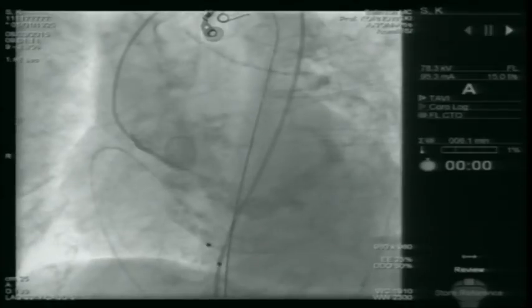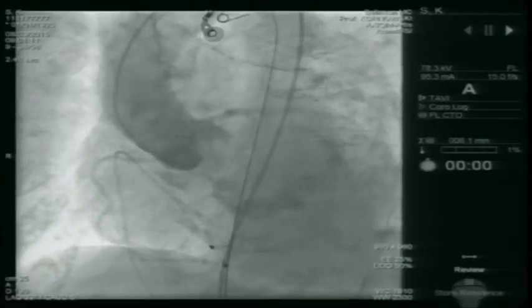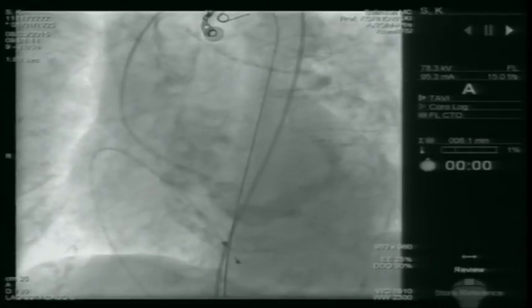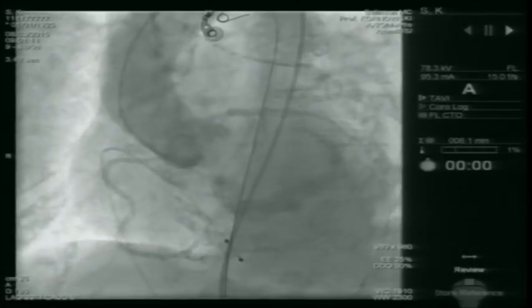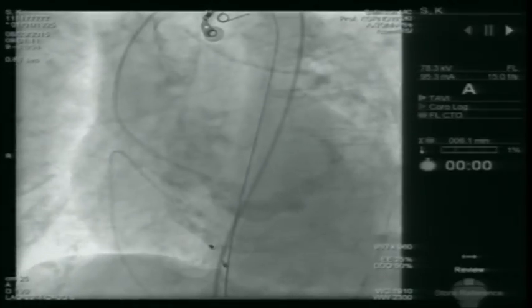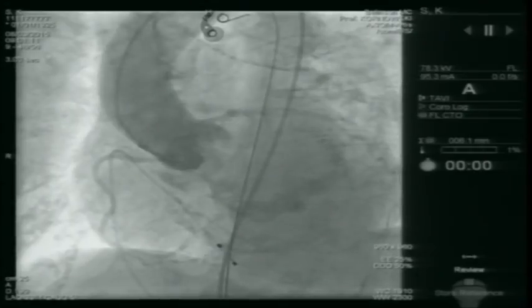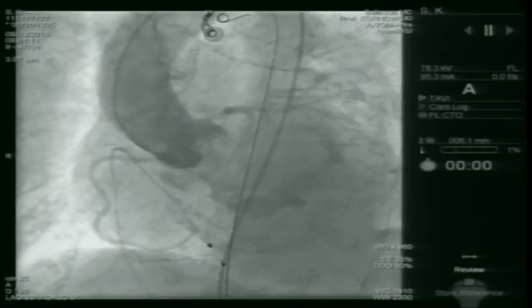You see heavy calcification of the aortic valve. There is also severe MAC, mitral annular calcification. We freeze this injection, which would be our landmark for the implantation. It is very important to be as perpendicular as possible. And we have also information which is derived from the CT about perpendicularity.